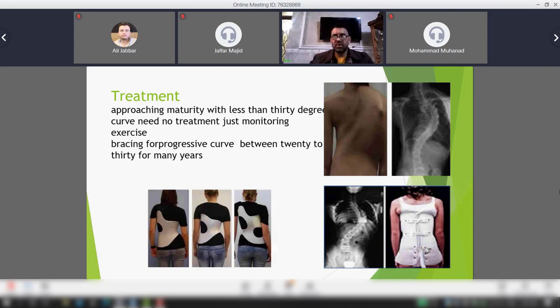And then we go for the spine itself. We take an angle نسمها الكوبس انجل. الكوبس انجل تاخذ the upper edge of the uppermost vertebra بالcurvature، يعني حافة اعلى vertebra بالcurvature، and the lower edge of the lowermost vertebra of the curvature. ناخذ line من عندها ولاين من lower edge مال lowermost vertebra، وهذا من يتقاطع يسمونه الكوبس انجل.